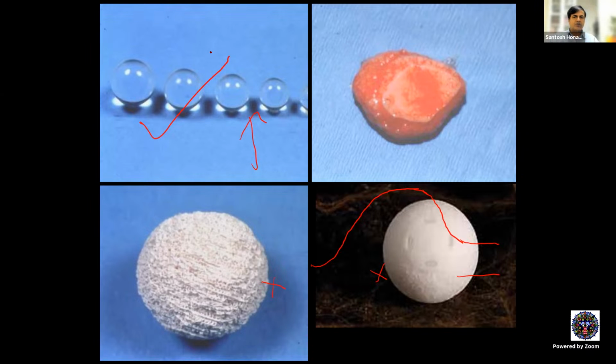It is impossible to remove an integrated implant without causing substantial trauma to the socket, which will then only accept a dermis fat graft as a replacement. So if you want to simply exchange an implant, then PMMA and silicone are the ones which you need to put because they can simply be removed and replaced. Hydroxyapatite and porous polyethylene cannot be removed easily or can never be exchanged. You can only put a kind of piggyback implant on top, like a dermis fat graft. So this is the safest implant for a child or an adult with intraocular tumor.